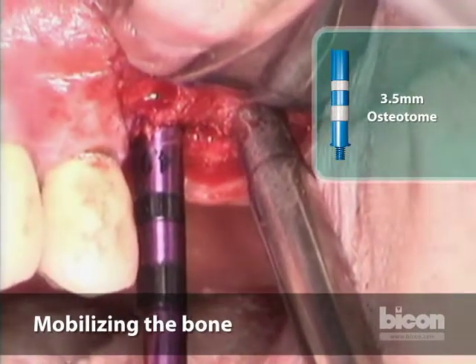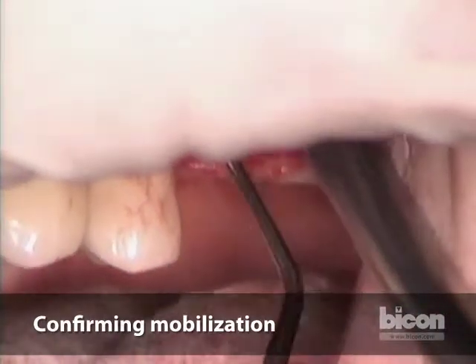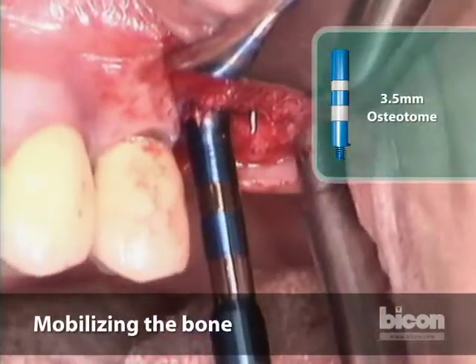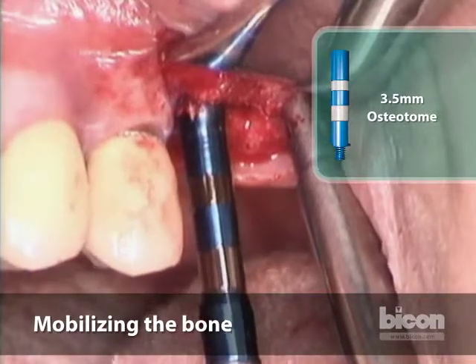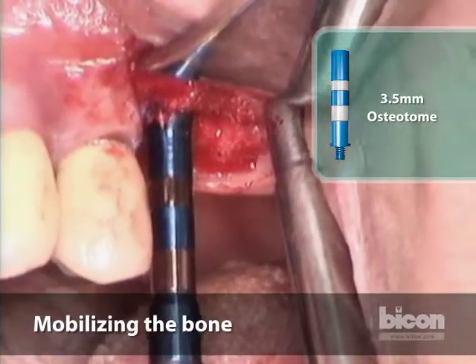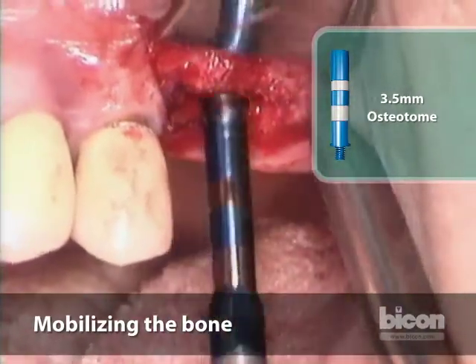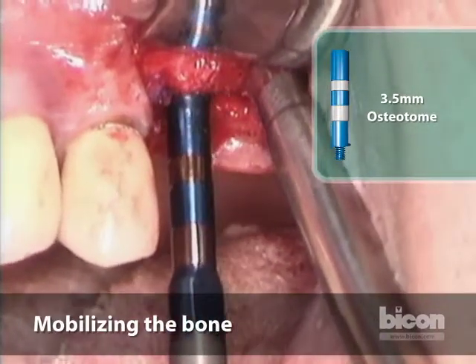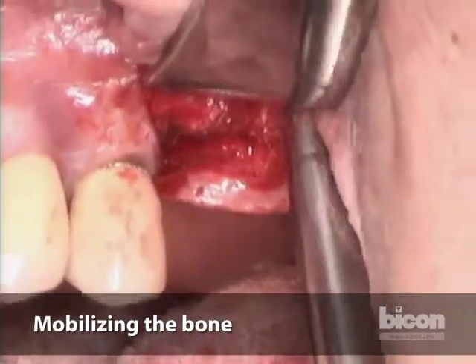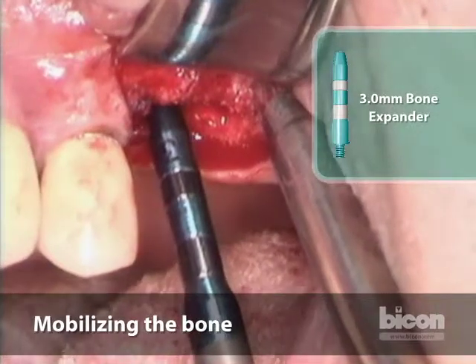We're going to quickly and surely mobilize the anterior portion. I just want to make sure we have it all mobilized, so I'm using a sinus lift curette. This area is a little bit wedged in the mesial part and we'll keep mobilizing it. We're going to switch to a thinner site expander because I want to be able to exert some pressure more on the mesial, as it's not mobilizing as fast as I want it to.